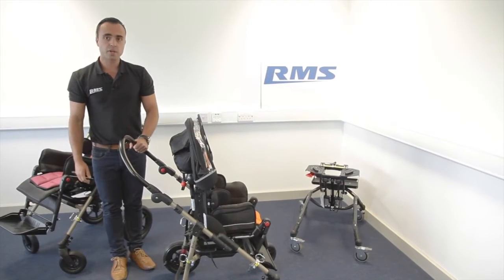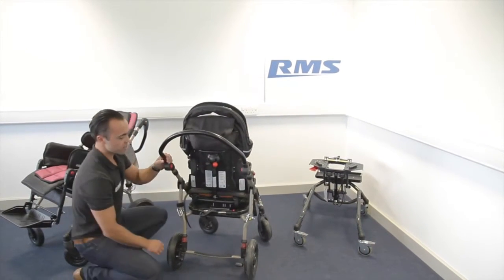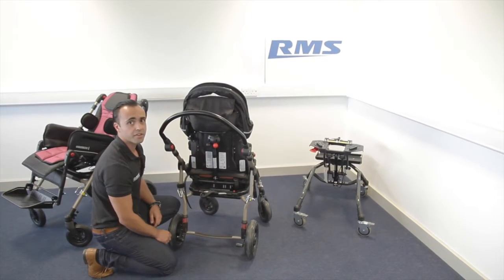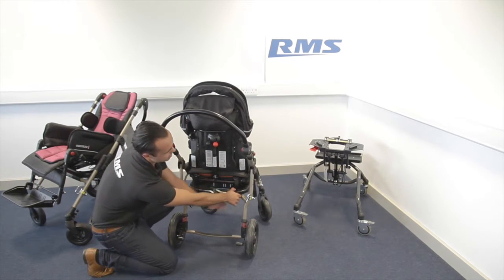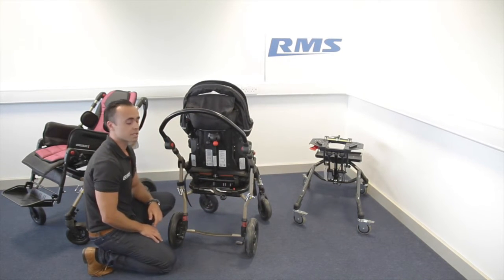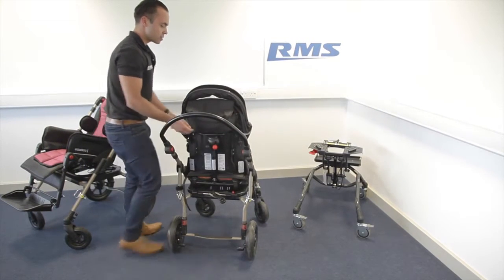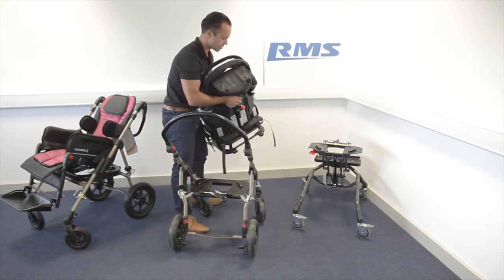To fold the chair, you need to fold it in two pieces. You have this mechanism here. You need to press the safety button — it's a red button — press it, hold it, and then just unlock the seat. Always apply the brake first, and then you just need to slide the seat off.